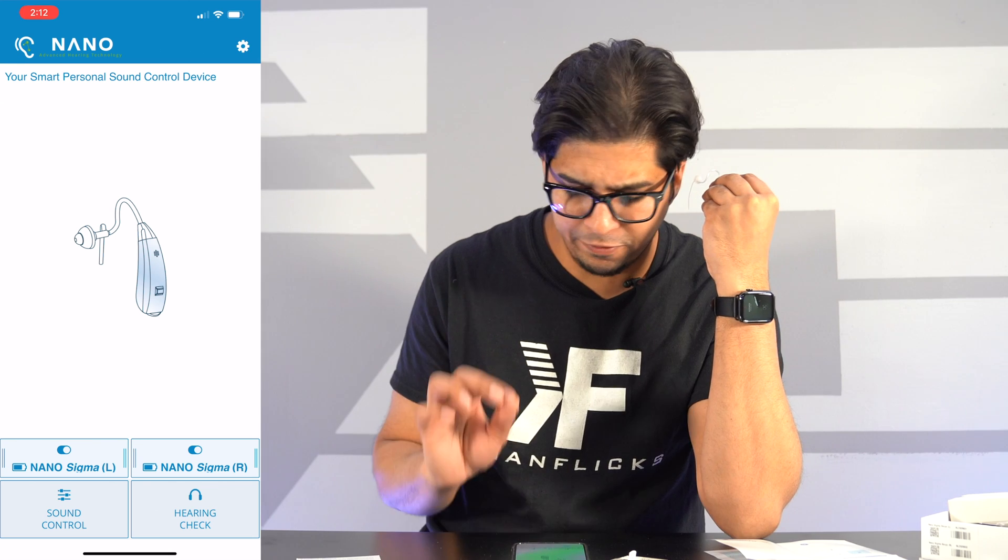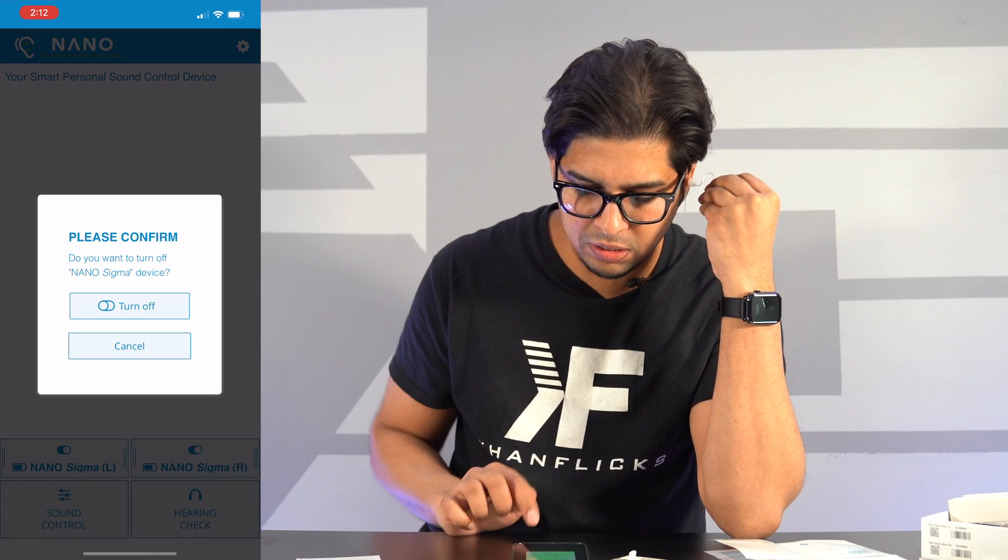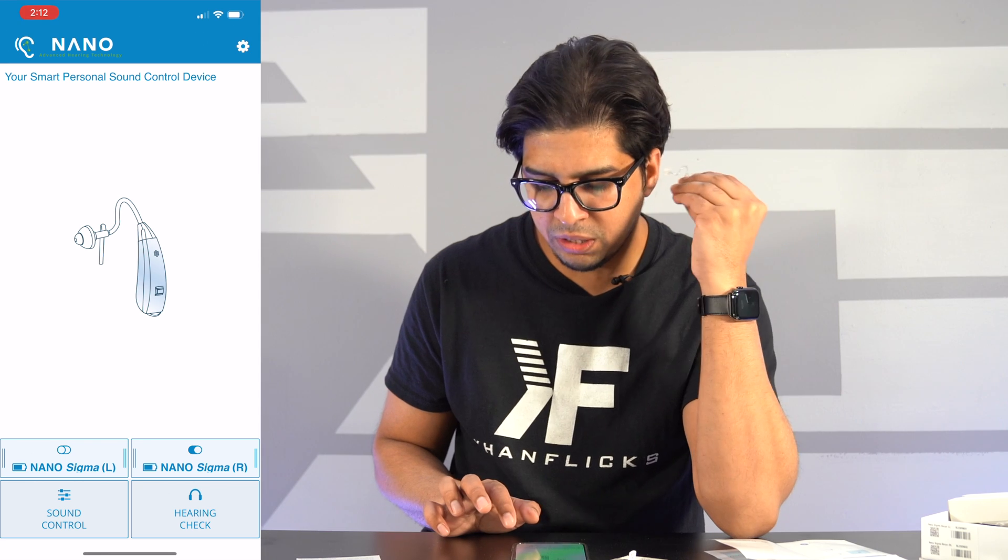They made it very convenient and very easy to use. You can simply turn it off just like this, and now this one is off.